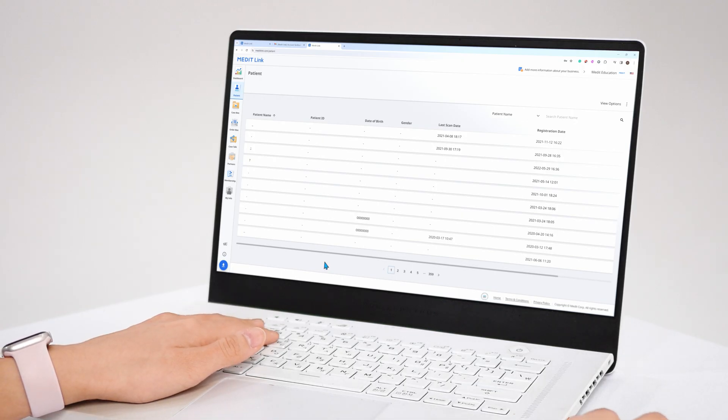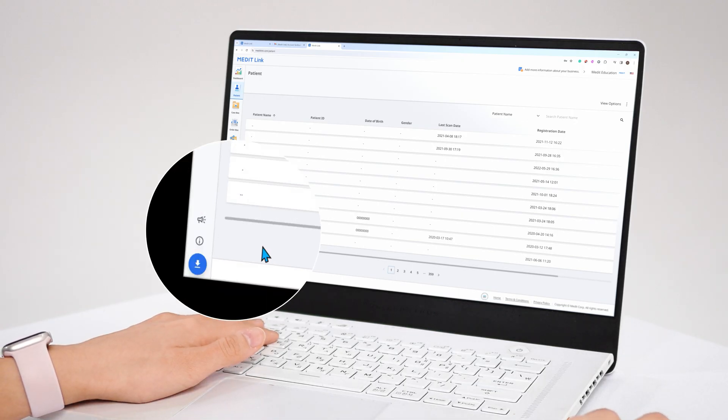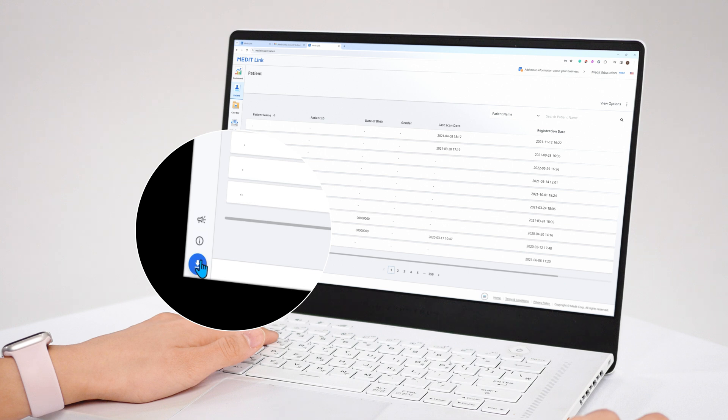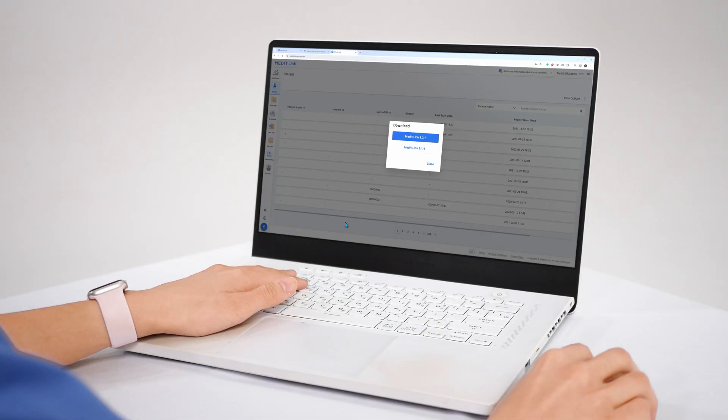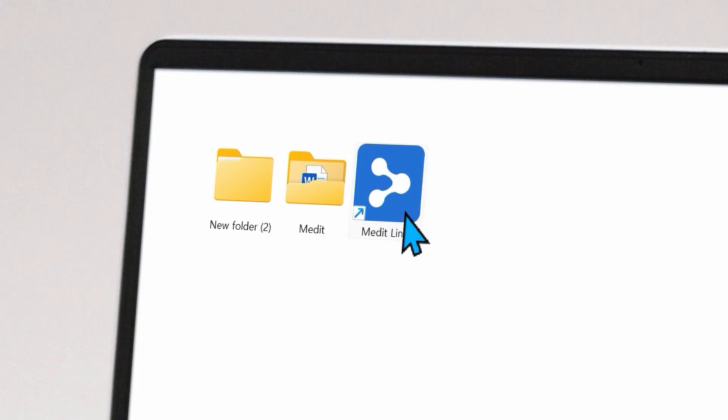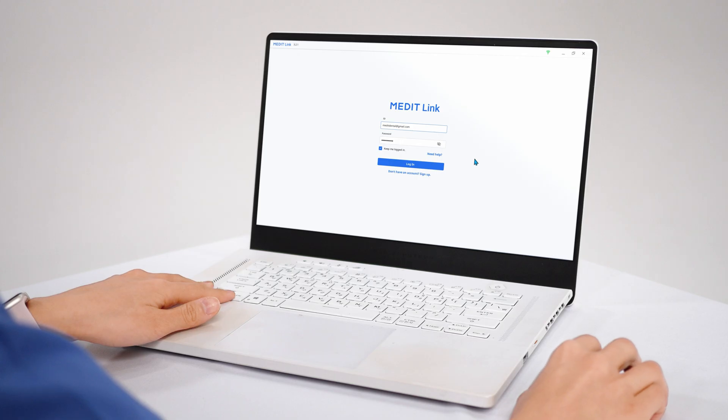Click the download button on the bottom left corner to download the MeditLink desktop application. When downloading is finished, install the program and log in using the account you just created. There we have the scanning program.